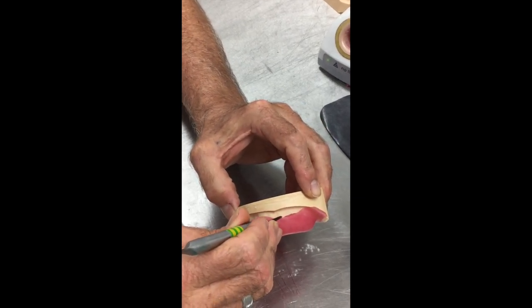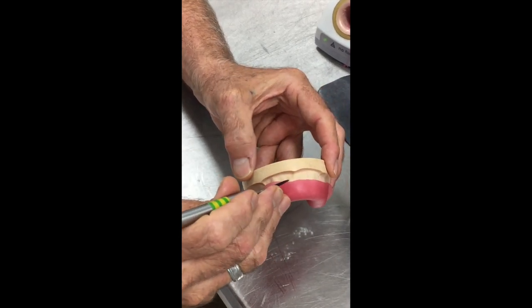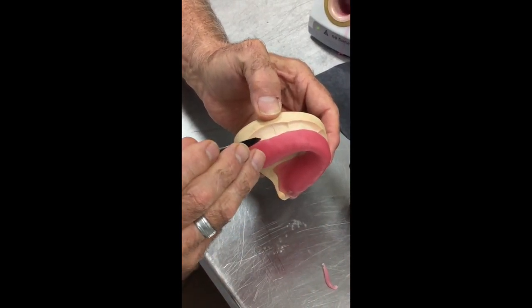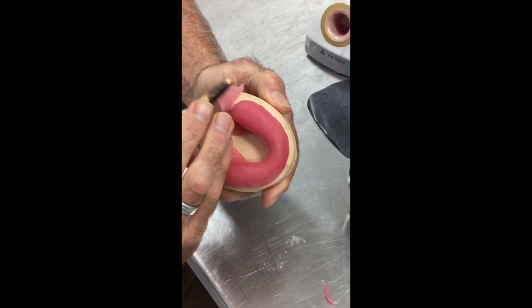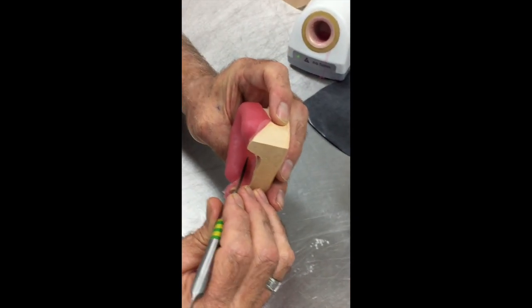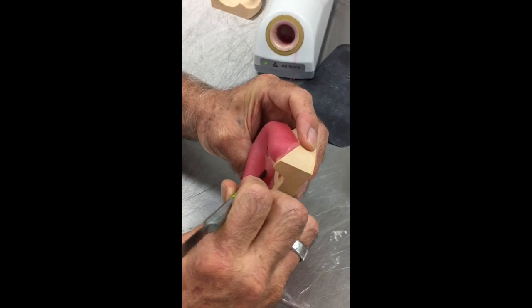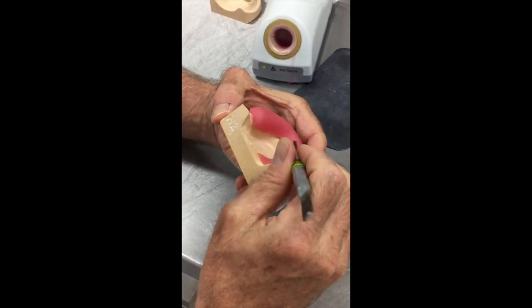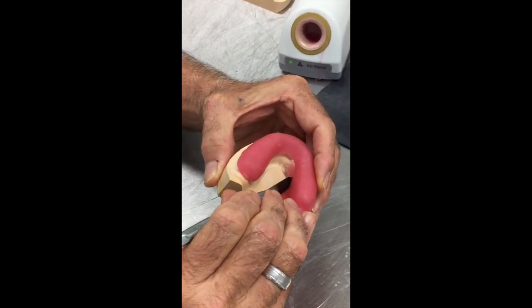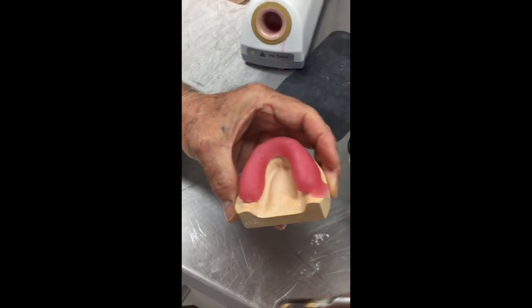Okay, then we're simply going to go around and we're going to cut it back to our wax all the way around. Now, I'm using a pink material here. If we had a different coloured material, you could, of course, see the pink wax through there a lot more clearly, and this trimming process would be a lot easier for you. But it's still not too difficult, even when it's pink. You can see enough of it to take off that material.